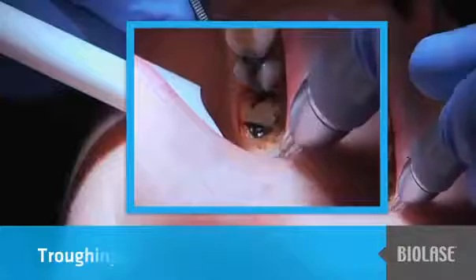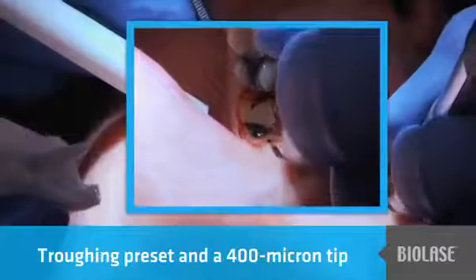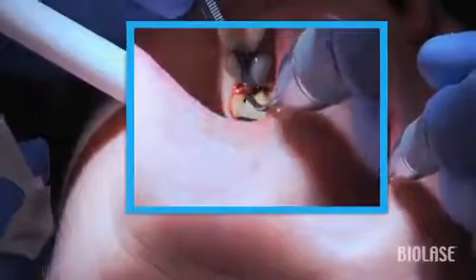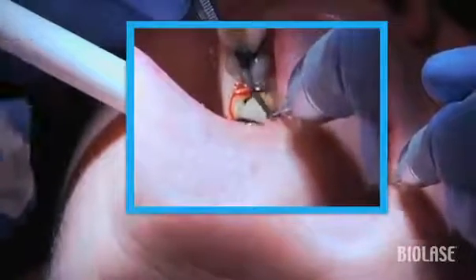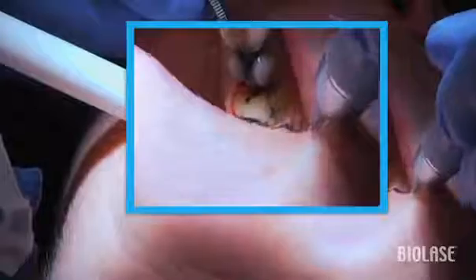Using the WaterLase troughing preset and a 400 micron tip initiated, I held it parallel to the long axis of the tooth. You are just extending the tip mesially below your crown prep margin and using a brushing motion, rubbing the adjacent gum tissue. If you directed the laser tip perpendicular to the tooth, then you would be shortening the height of the tissue rather than thinning it, and in effect, you would have done a gingivectomy.